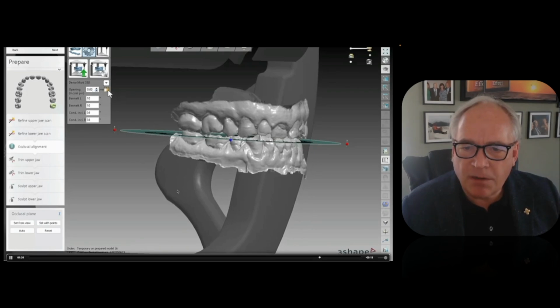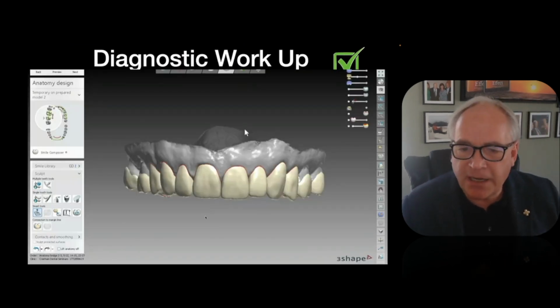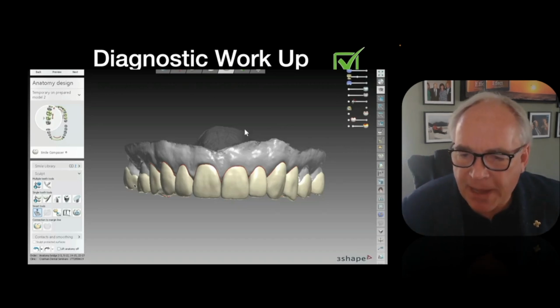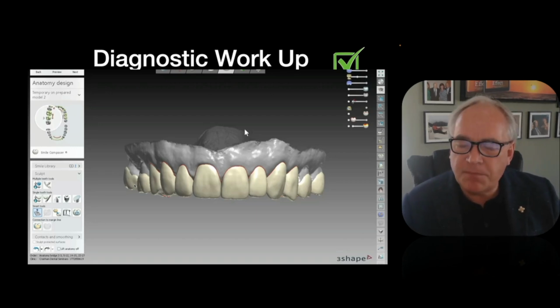Now what we'll do is start bringing teeth in. And in my plan here, I'm visualizing doing crowns first bicuspid to first bicuspid, eventually crowns on the molars. But for now, to try to phase him, we have the capacity to print little toppers that could go on those back teeth that basically open the vertical. And we can bond those in place. We use these a lot to help patients just like Brian who need a little bit of time.